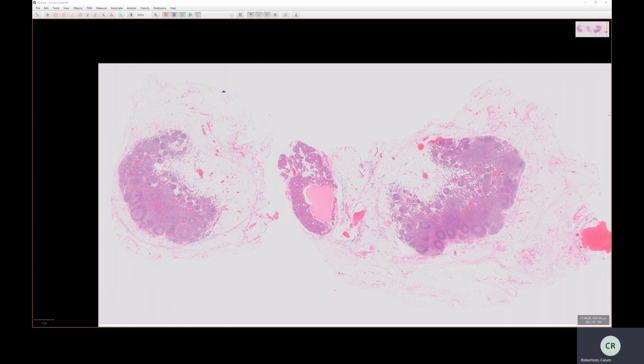Within hematopathology, we look at lymph nodes very closely, and that is primarily for the diagnosis of lymphoma or other hematopathological conditions. And H&E is important, but it needs backed up with panels, large panels, sometimes multiple panels of immunohistochemistry. And it's very complex and specialized.